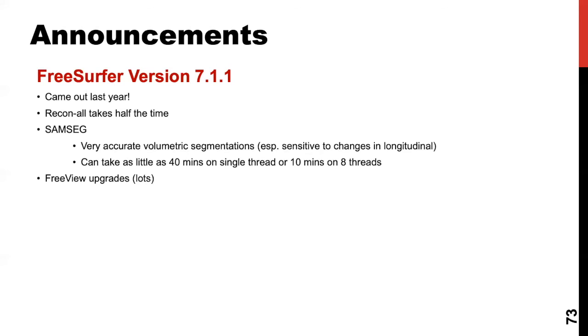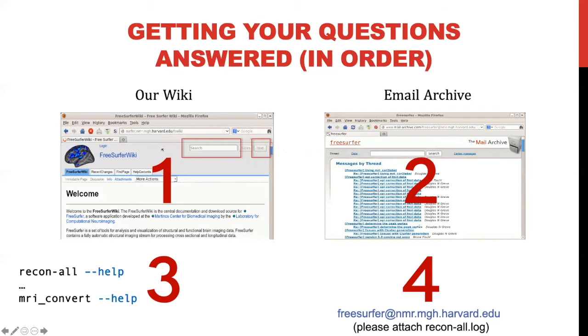And so again, our wiki, one thing that we like to mention is when you're searching in our wiki, use the text button. I know this is so minute, but use the text button. It'll show up more results than if you type in your search items and then hit titles. But I would suggest going there and looking up MRI register, because I think that's the one that you're going to want to use to resample and resize.